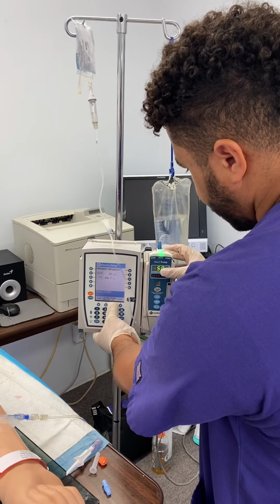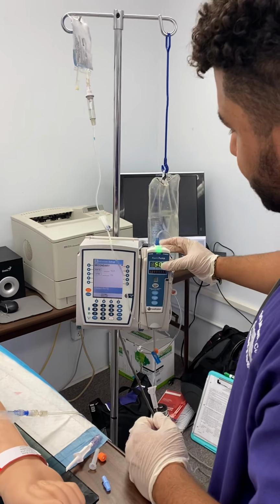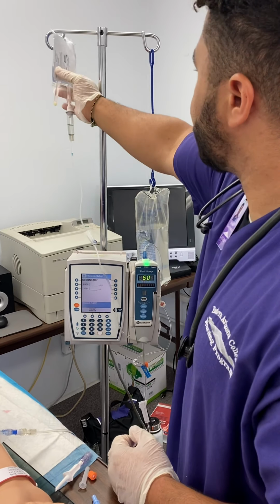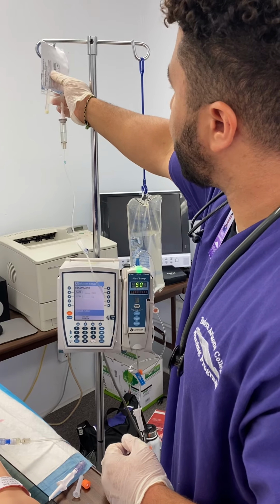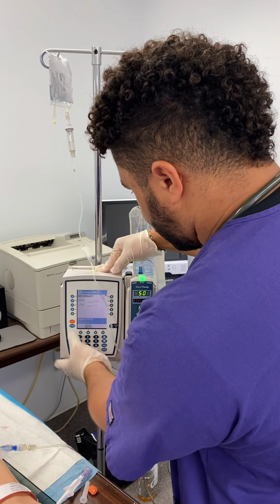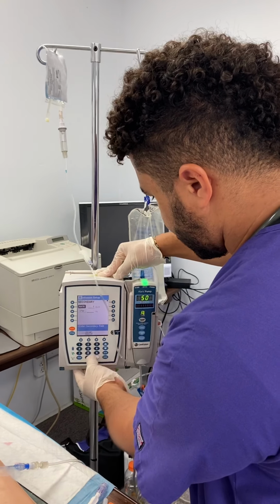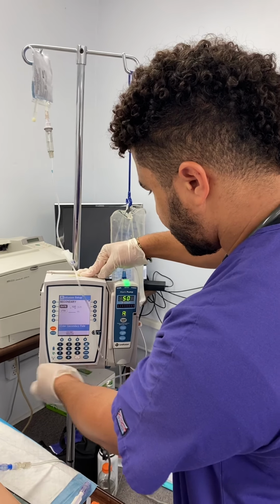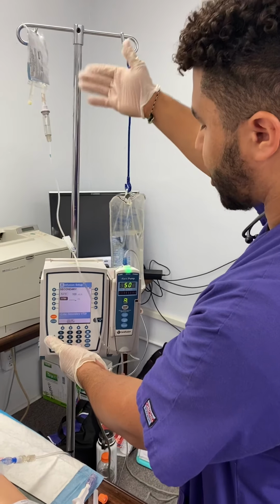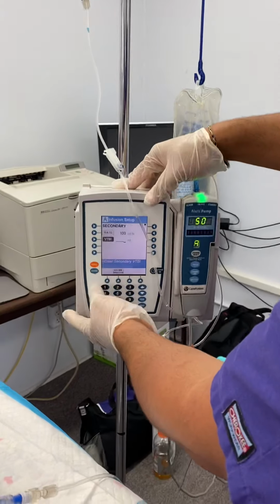You're going to select secondary. Now you have your rate, and judging from the book and everything, we do want 100 mLs to be infused in that hour. So we have that 100, and then the volume obviously is also 100, so we need all of it to be infused.